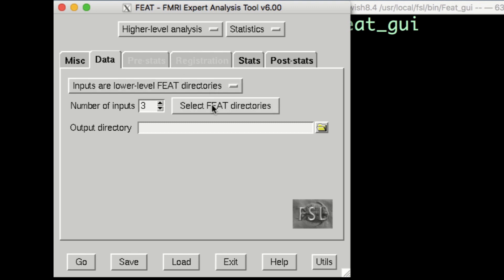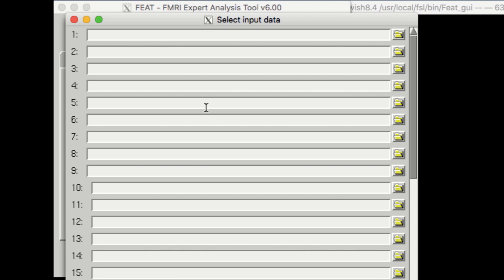Since we had 26 subjects with two runs each, we have 52 feat directories total. Change the number of inputs to 52, and then click the button Select Feat Directories.